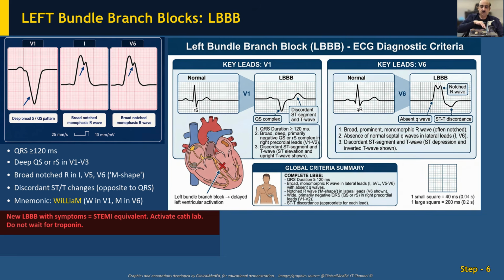Now, we discussed before in the cardiac axis or vector, V1 and V2 are on the right side, in the right fourth intercostal space. So V1 is here, V2 is here. Because they are away from the vector and the cardiac axis, they will be predominantly negative. In this situation, you will have either a QS pattern or a small r and a big S, so an RS pattern in V1 to V3, which means there is a tiny R wave but a deeper S wave. That is due to the left ventricular depolarization, which takes place from the right ventricular conduction, right to left.